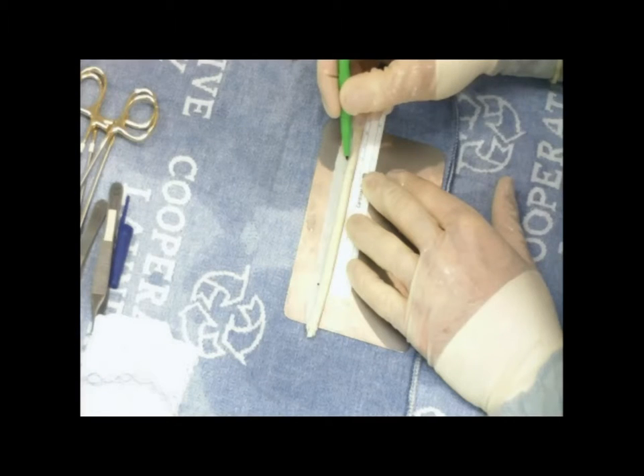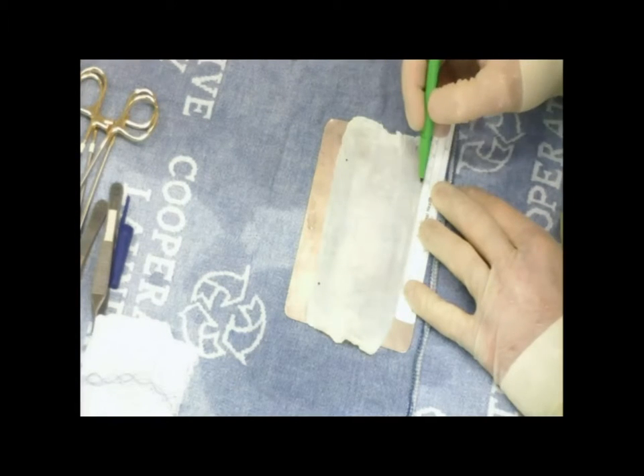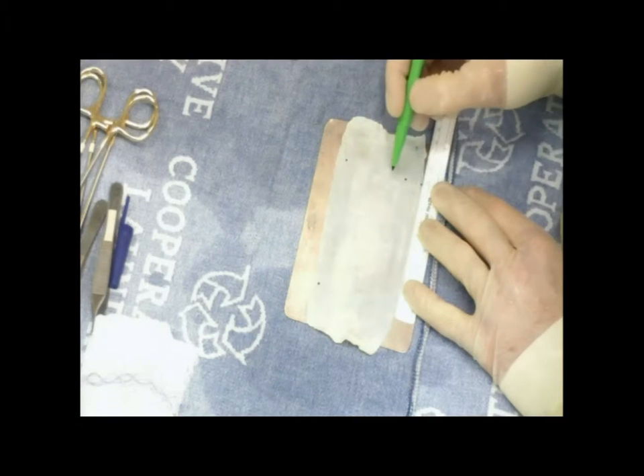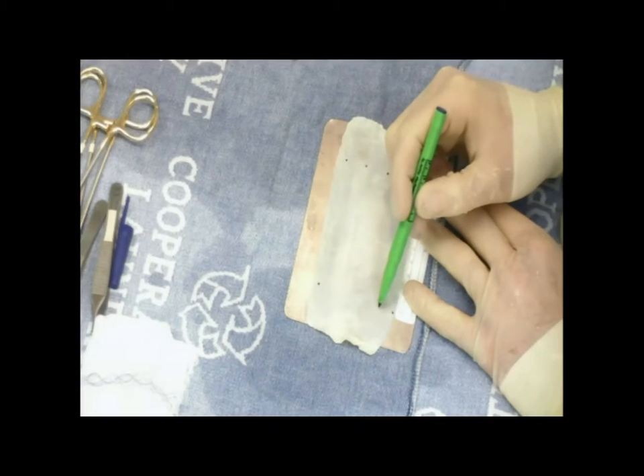There aren't really set parameters for the width of this graft. It all depends on the graft material you have and its thickness. In general, you don't want to use the thinnest section. You also don't want to use the thickest section either. It's sort of the in-between zone.